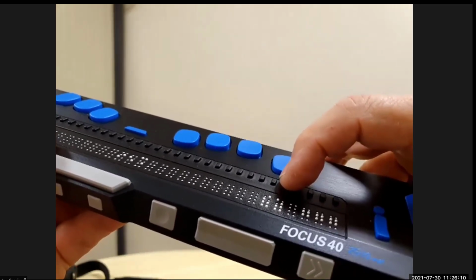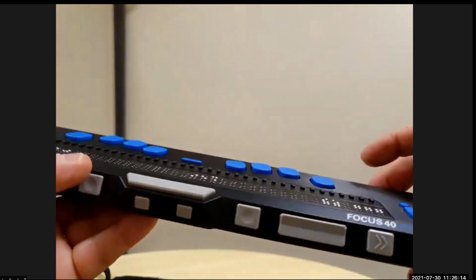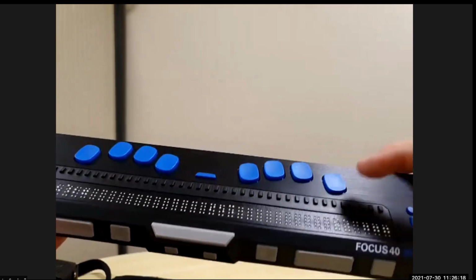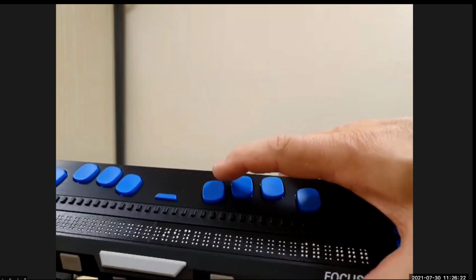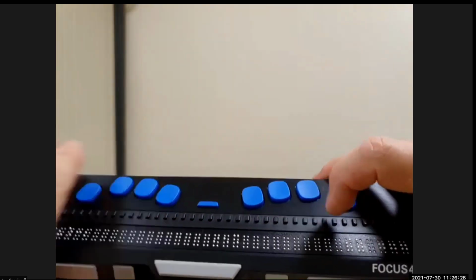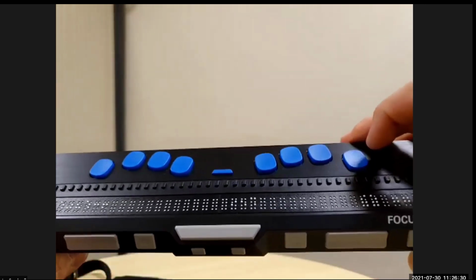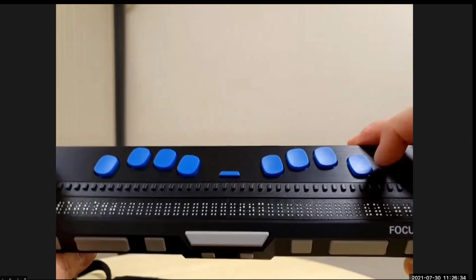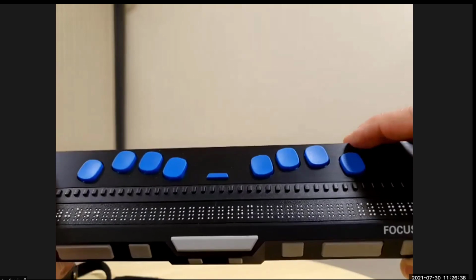If you're using one of these devices on a Mac, they're used for opening programs and a few other bits and pieces. Directly behind the cursor routers, we have our Braille keyboard, the 8-key Braille keyboard. So your standard 6 dots, your Enter, and your backspace, which are also referred to as dot 7 for the backspace and dot 8 for the Enter.